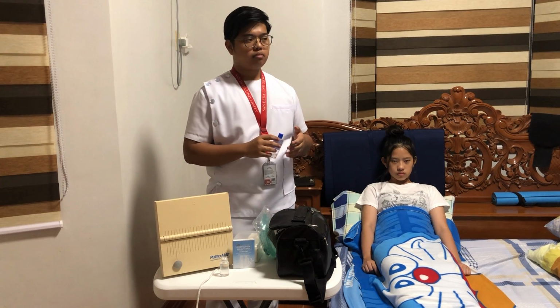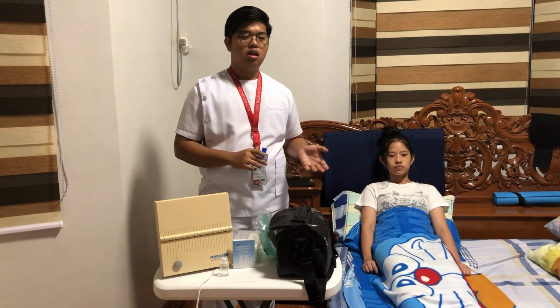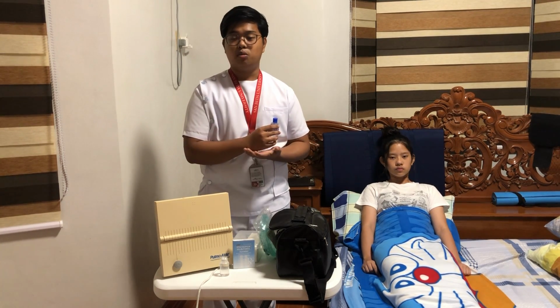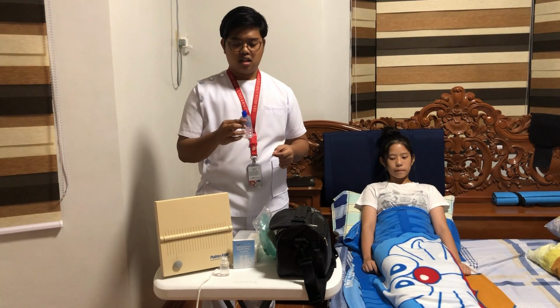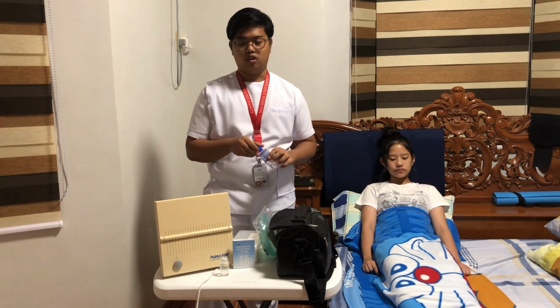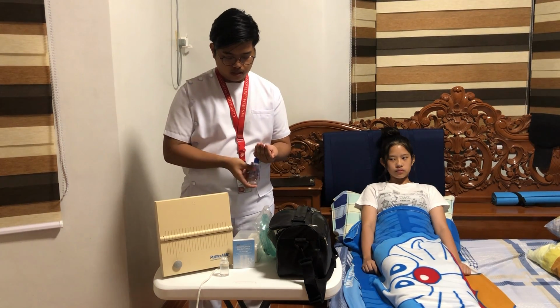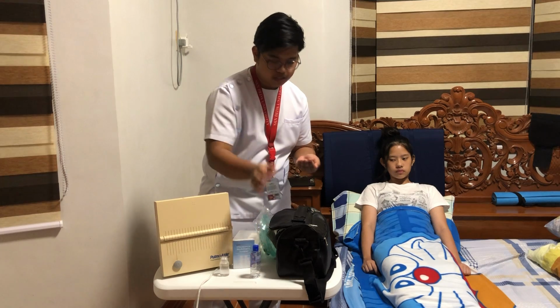And then after that, we need to perform hand hygiene. In performing hand hygiene, we can either use isopropyl alcohol or soap and water. The difference is that soap and water works with visible stains that we can see on our hands, and in this case, there are no visible stains on our hands, so we're going to use the isopropyl alcohol. Apply a generous amount and observe the proper steps.